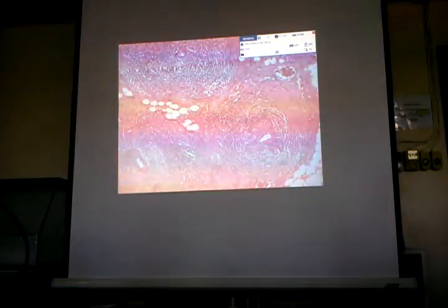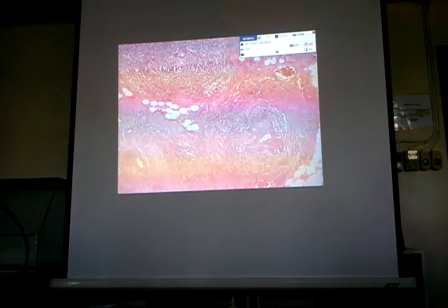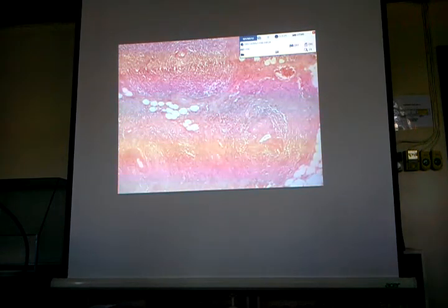And then, because the infiltrates are lymphocytes, the inflammation that will develop is chronic or acute? Chronic. That is another feature of chronic inflammation. How do you call that? Fibrosis. So we are seeing here the histologic features of chronic inflammation. Mononuclear infiltrates, and then evidence of repair, which is fibrosis.